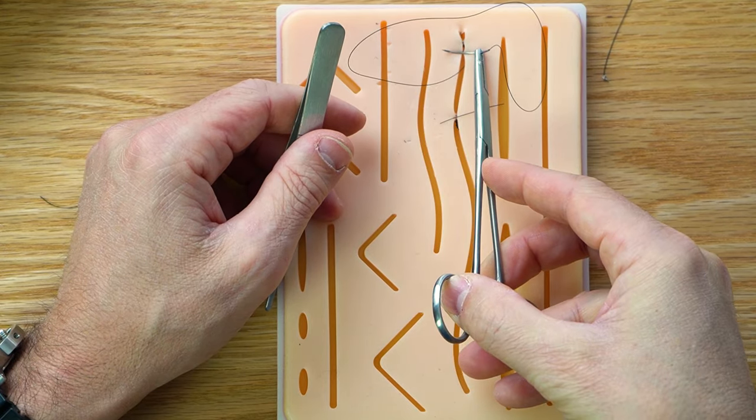And this one, actually the easiest one I'm gonna show you, what I do is just go backwards. I just start going backwards. And if it's a long enough incision and you ran it, then what's gonna happen is you're gonna get tangled up. And especially if this is a polyfilament suture, then that's all I do. I stop doing knots and stuff because, especially with polyfilament, well, even monofilament, you throw a knot and it has a potential to get the body to try to spit the stitch, right? And do a little suture abscess type of thing. Or it tries to come out or it's not very flush because there's a big knot in there and the person's skin is really thin and they come back and they complain, hey, I got this big knot thing in here.